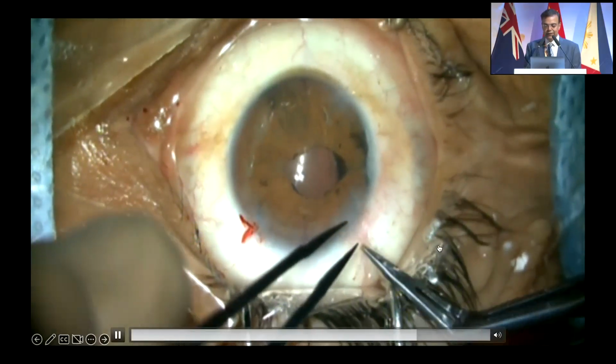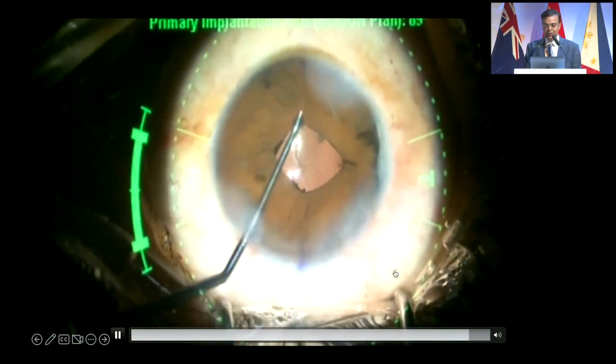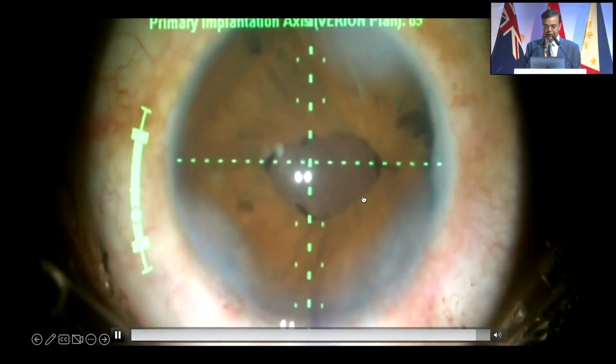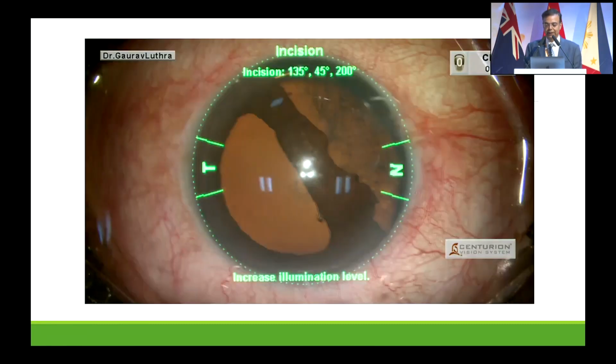So you can see that at the end of surgery, frankly, the pupil looked much better centered. I did a little more sphincterotomy to recenter it after putting the suture, and in the post-op period, this eye looked like this. It's not beautiful to look at, but you can see that now the pupil is at least ensuring that the IOL is well centered and the visual axis is absolutely clear. Otherwise, the patient's outcome would have been unhealthy.